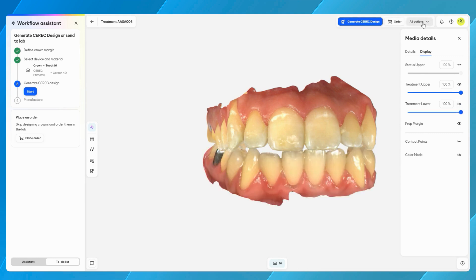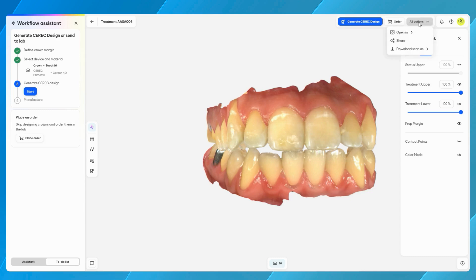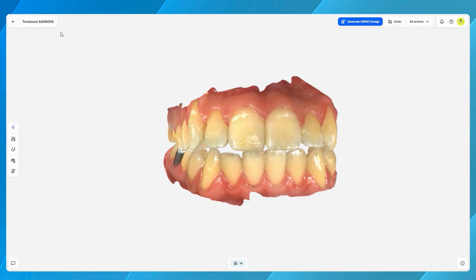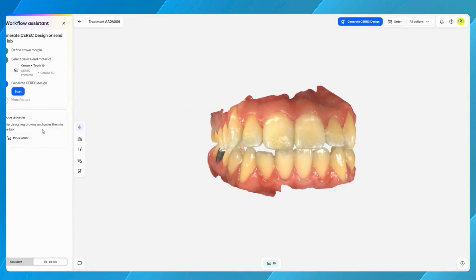A familiar action bar is located at the top, providing quick access to commonly used functions. For an optimized focus on the intra-oral scan and the planned crown, both the Workflow Assistant and the media details can be hidden when needed.